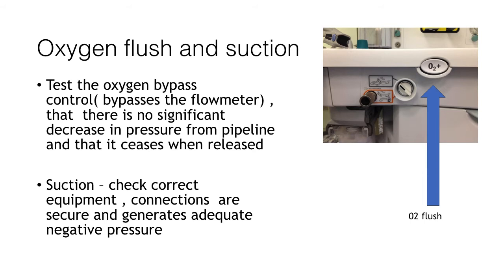Next we need to check the oxygen flush and also that the suction is working. The oxygen flush is essentially a bypass control so that it will deliver oxygen at the pipeline pressure — at 4 bar or 400 kilopascals. You should test the oxygen bypass control and there shouldn't be a significant decrease in pressure, and when you stop pushing the oxygen flush the gas flow should cease. Secondly, you need to check the suction — you should check that you have the correct suction equipment, whether that be a Yankauer sucker or a suction catheter, ensure all connections are secure, and that when the suction is turned on it is able to generate adequate negative pressure to function correctly.